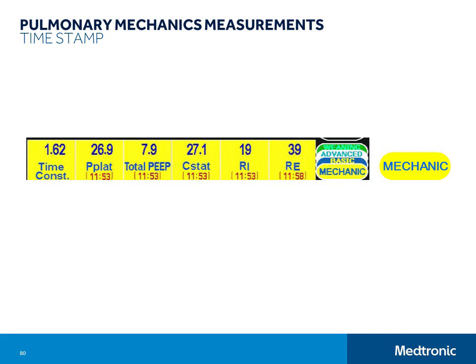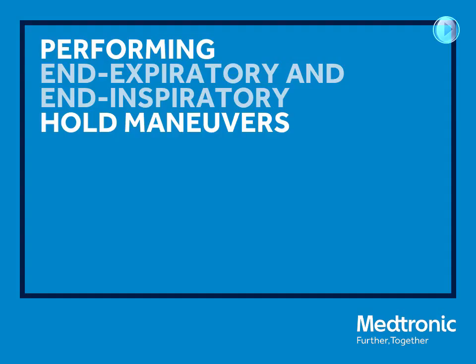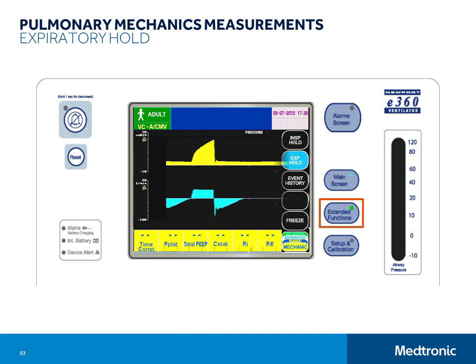Here is the process for doing the end expiratory and end inspiratory hold maneuvers. Touch the extended functions button. Then touch and hold the expiratory hold button and continue holding until past when the next breath is due to begin, then let go. During the hold, gas flow to the patient is postponed while the exhalation valve is held closed. The airway opening and alveolar pressures equilibrate as the end expiratory state is prolonged. If patient exhalation is passive and the expiratory phase is held until a quasi-steady pressure is achieved, the circuit pressure measurement will provide a reasonable estimate of the average alveolar pressure. This end expiratory base pressure is logged to the E360 screen as total PEEP, with the time at which it was collected recorded in military style. The total PEEP value is also used in the calculation of static compliance, labeled CSTAT.